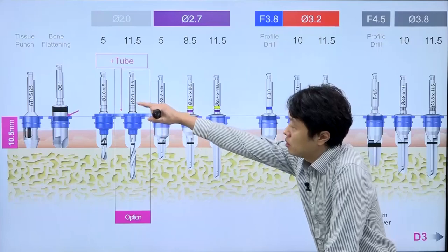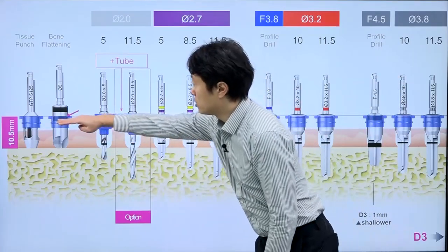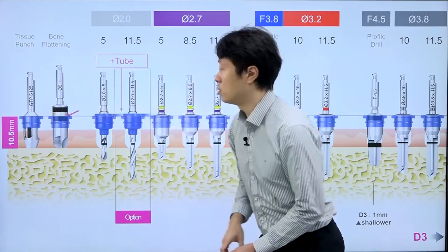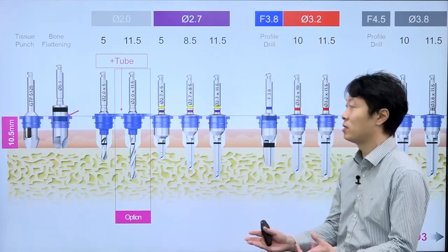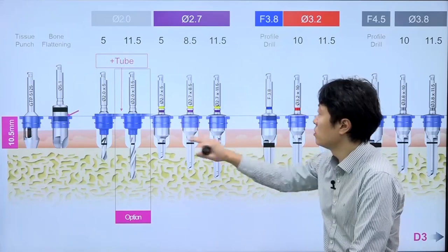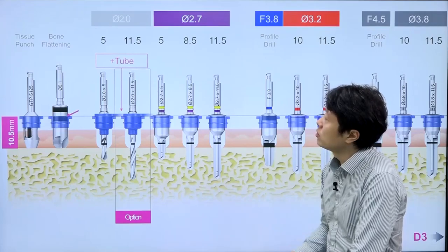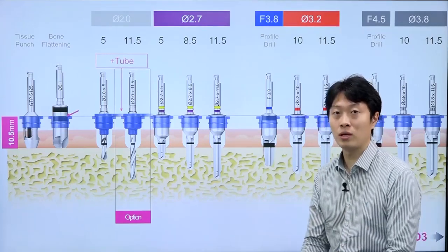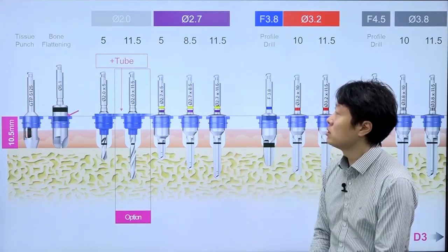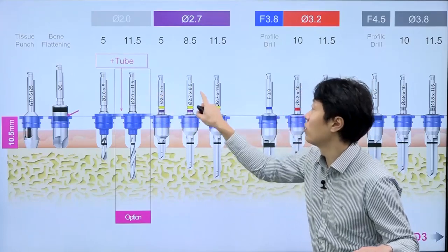The difference is in the drilling depth. In the case of a bone flattening drill, while drilling has been made up to this point with the 9 mm offset, drilling should be made one space above with the 10.5 mm offset. And later, when drilling with the initial drill with a stopper or final drill, you will notice that the drilling length is added by 1.5 mm each, although the surgical protocol for placement of a 10 mm fixture is planned. This is because the offset is 10.5 mm.